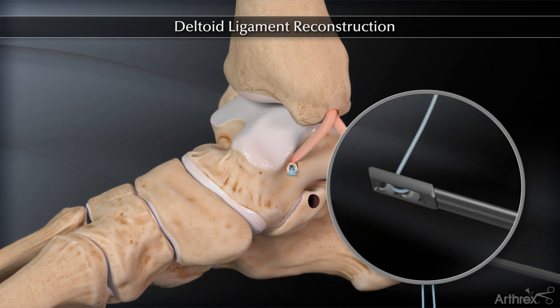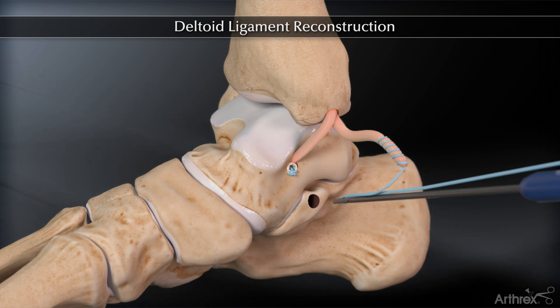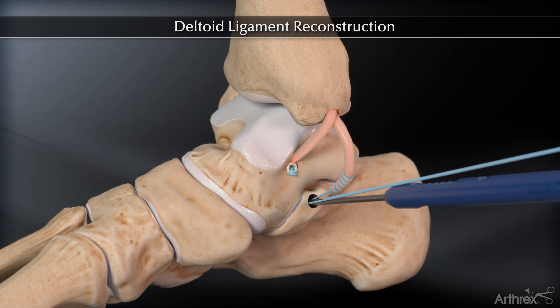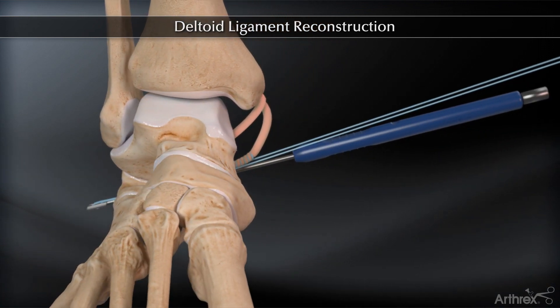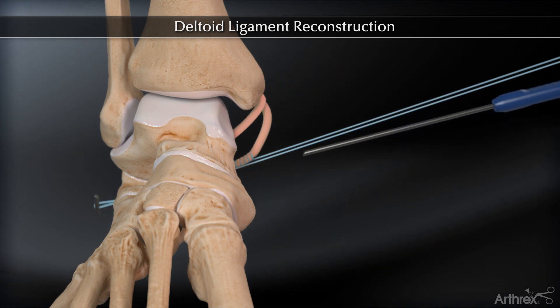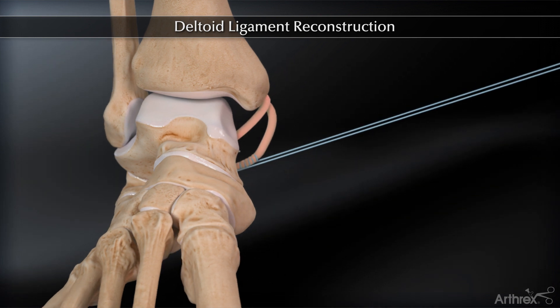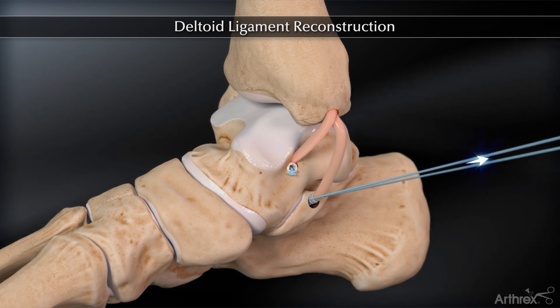Pass the free ends of the whip stitch through the cortical button to create a tension slide construct. Insert the button and sutures through the calcaneal tunnel until the button exits the lateral aspect of the calcaneus. The button is engaged laterally by unscrewing the back of the driver body and toggling on the blue fiber wire sutures. Further toggling of the fiber wire sutures exiting medially properly tensions the graft.